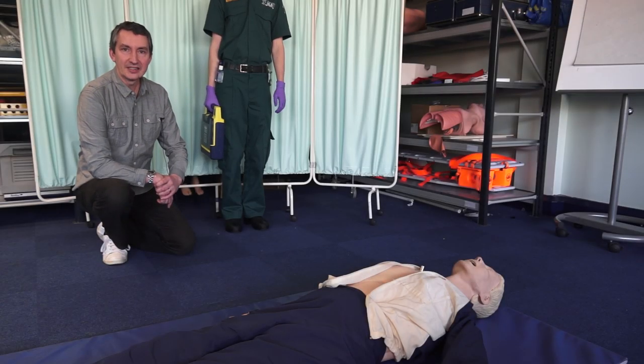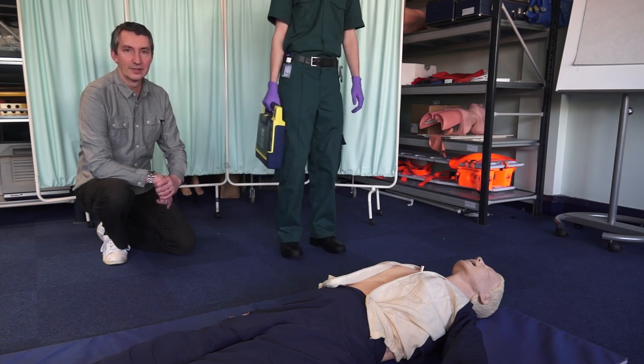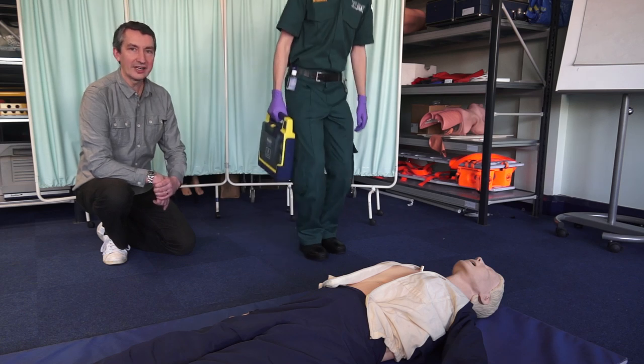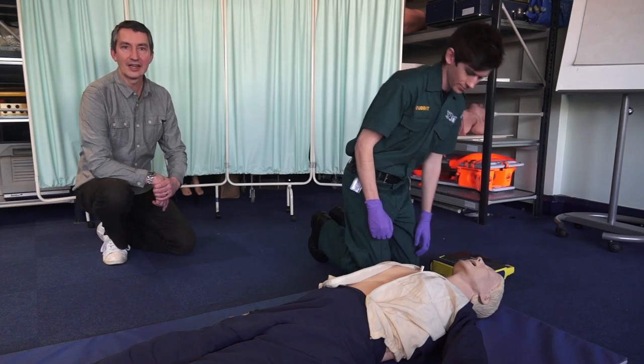It's important if somebody collapses in cardiac arrest that we approach with safety. Danger is the first thing to consider whenever there's a situation. In this circumstance it is safe to approach, so we're going to approach and check the patient's response levels, their airway, their breathing and the circulation.